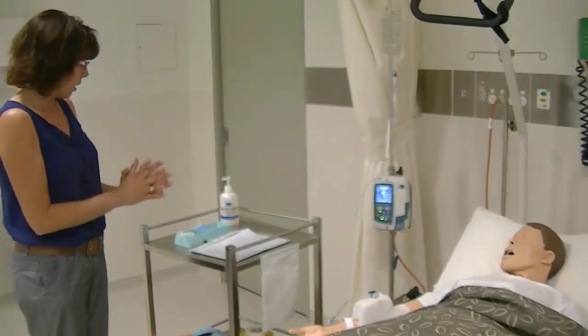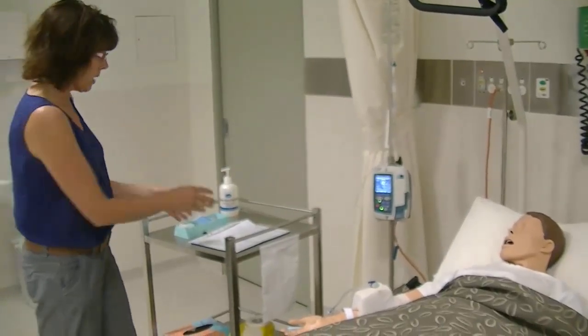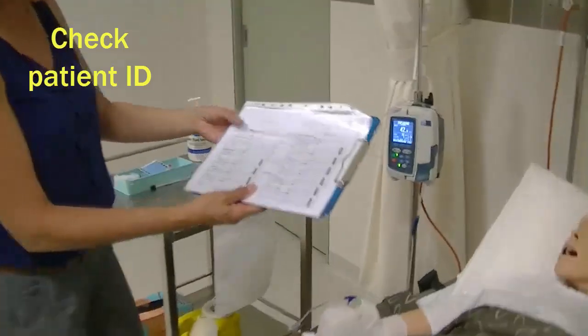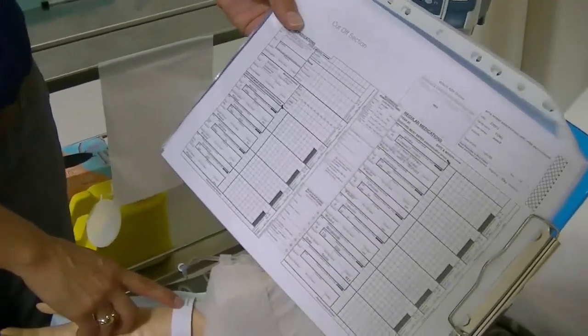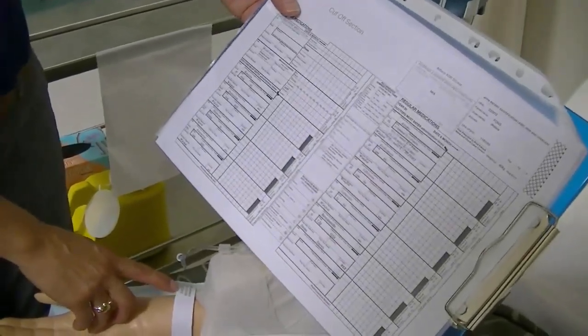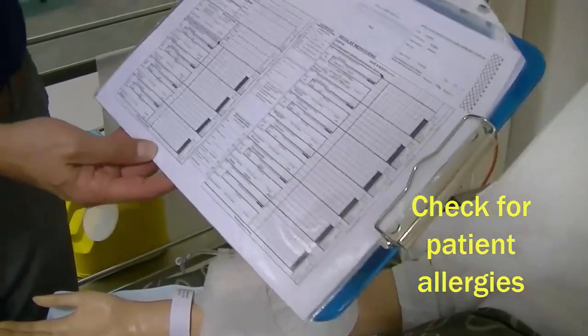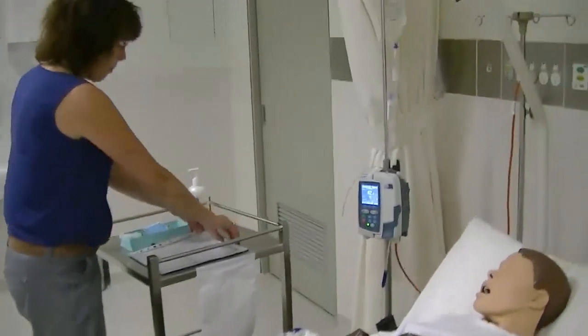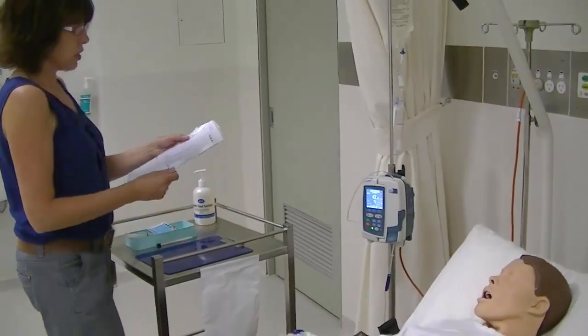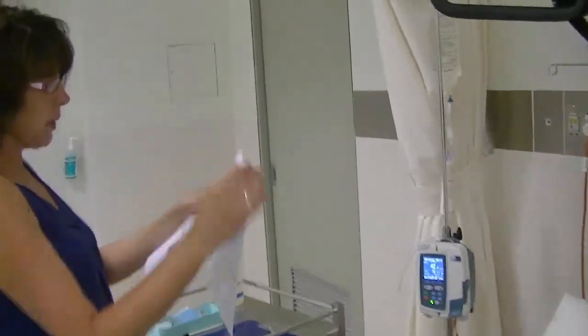Yes, please. Can I please just check your ID band? Sure. With the nurse, Jessica Fong, date of birth 11th of the 1st, 55. You are 233912. Jessica, are you allergic to anything? No, not to any drugs. Okay. Before I give you the drug, I've just got to make sure that your IV fluid is correct.